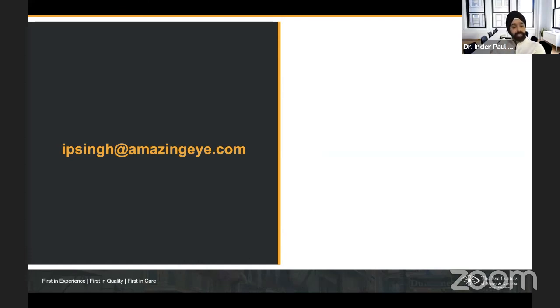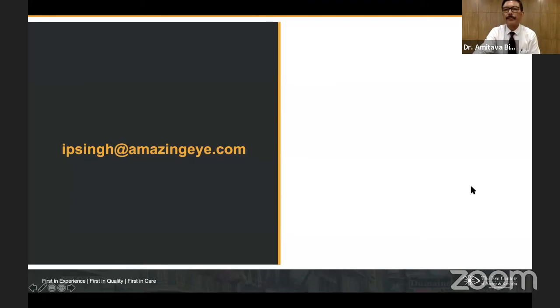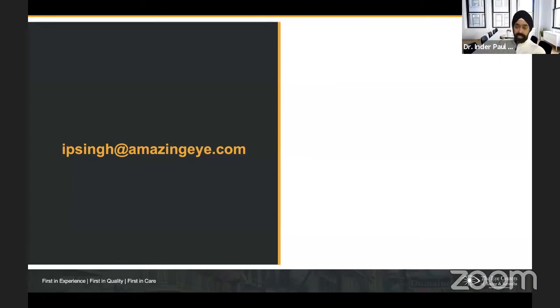So I think if you have good 3 to 6 month follow-up, you should be very safe. Is there any age group restriction to this procedure? I will say younger patients could be more difficult. Not that you can't do it, and it's not because they don't have a PVD. I have done it with people who do not have a PVD, and I tell them ahead of time that this laser may induce a PVD, but I tell them it's more the type of floaters they have.